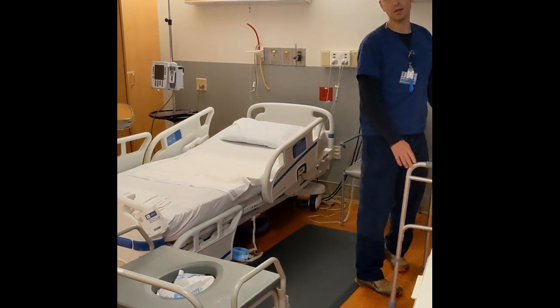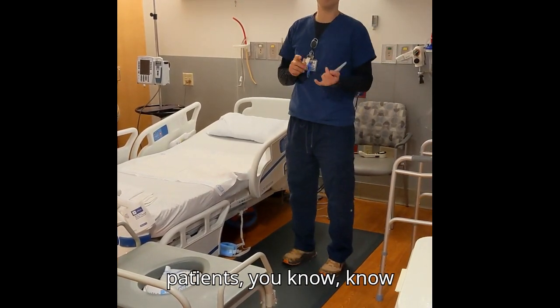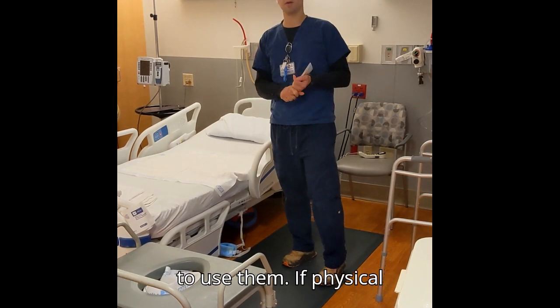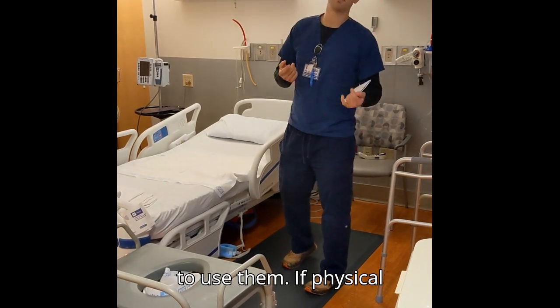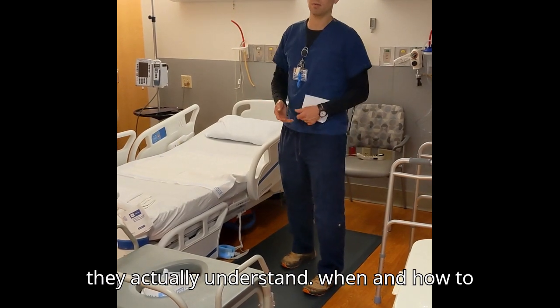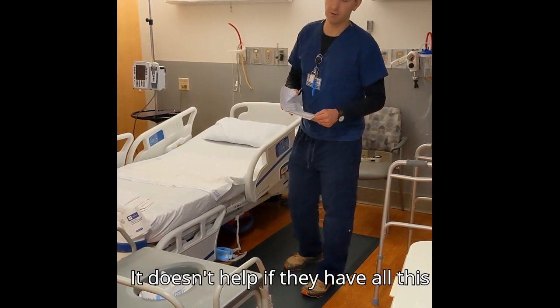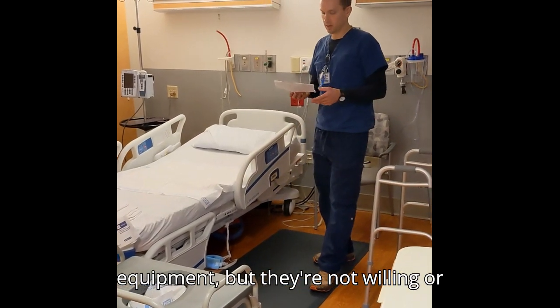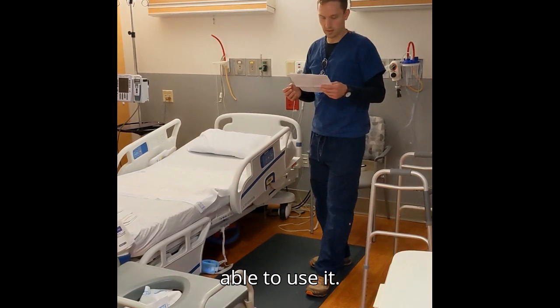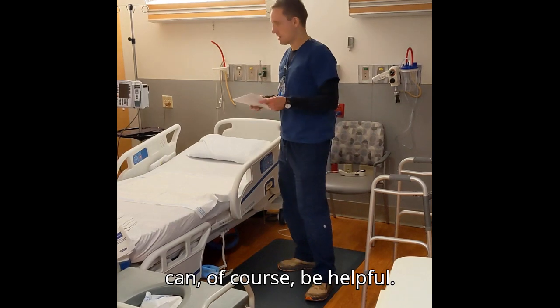So you should be making sure your patients know they have assistive devices and know how to use them. If physical therapy gave them to them, make sure they actually understand when and how to use them, because it doesn't help if they have all this equipment but they're not willing or able to use it. And being in touch with PT and OT about that can of course be helpful.